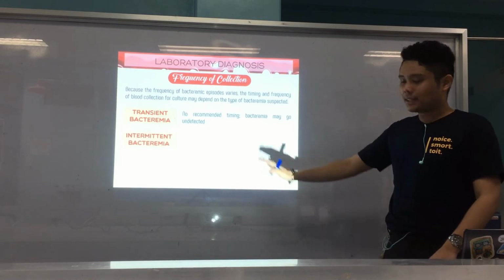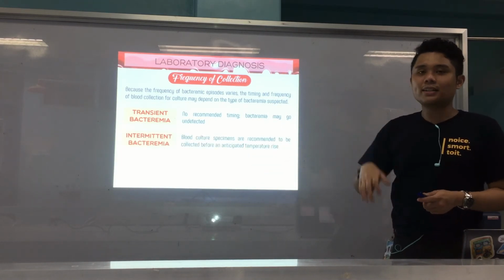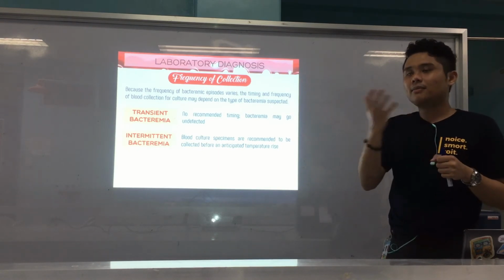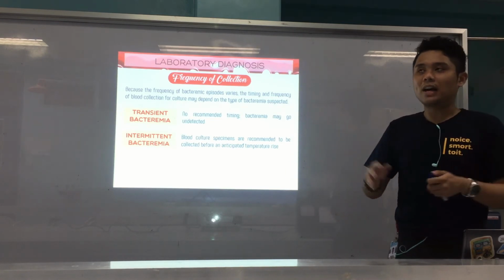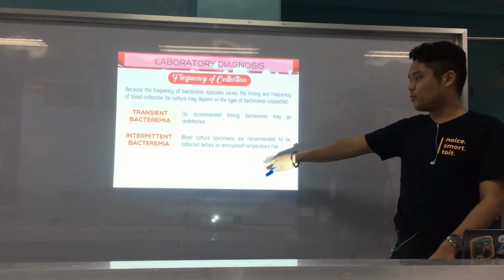But for intermittent, when you say intermittent, from time to time, naa ang kagaw, alright? From time to time. So, periodically, like sa gabi mo-increase ang kagaw, pagkaugma, wala. So, if ana, then you collect blood before the spike of the fever. Alright.